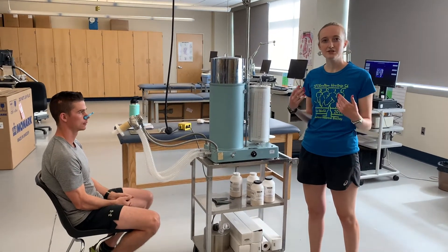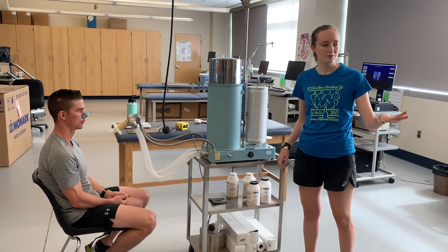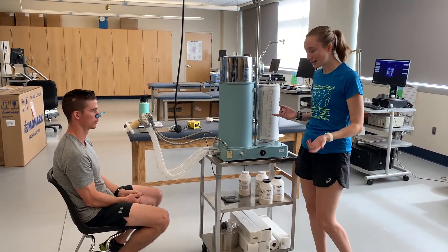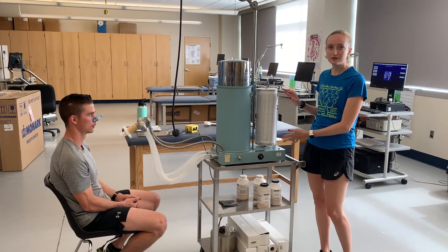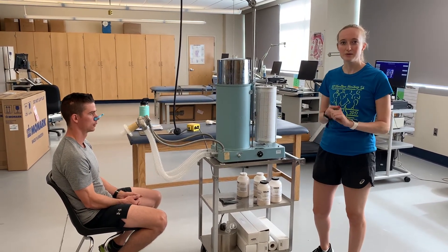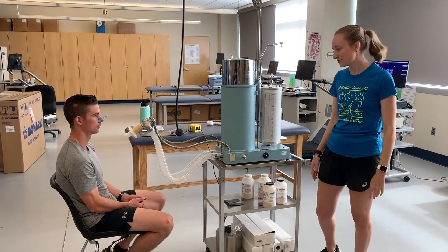Okay, so now we're just going to do two more curves just like that one — that one looked really good. We'll show you on the paper and have that available online for you to look at. Just so you know, there is a correction factor for the bell spirometer: when you're doing your calculations you'll have to multiply by two. That's just how the paper works out.